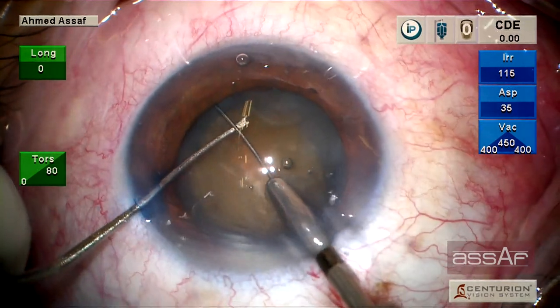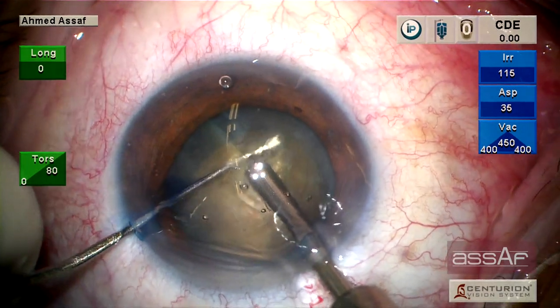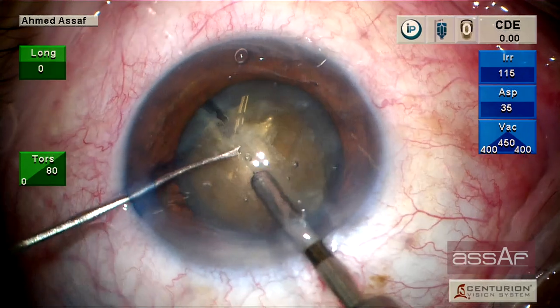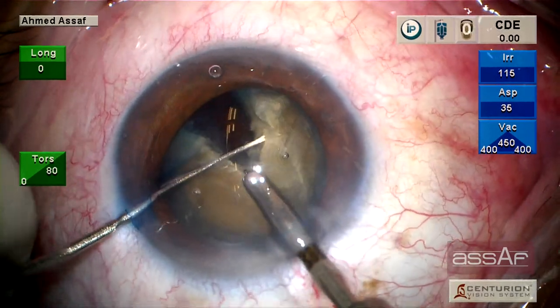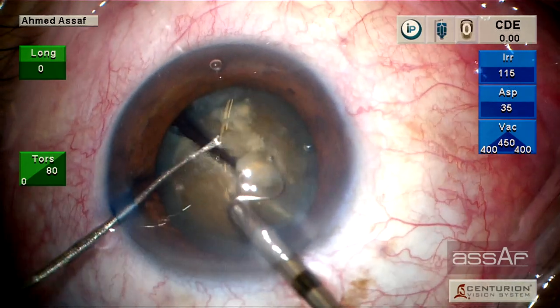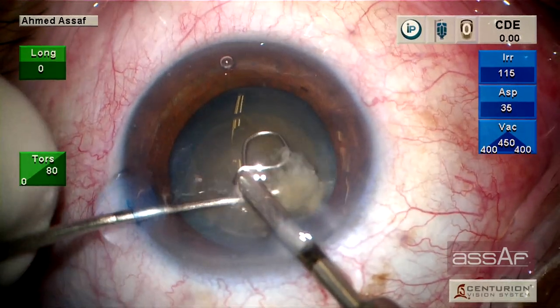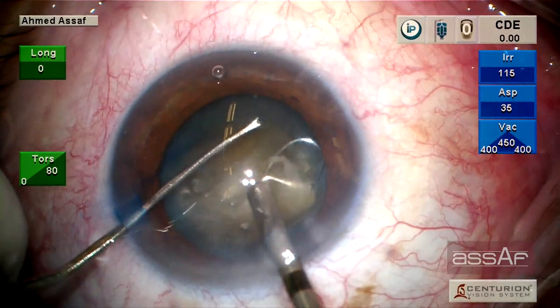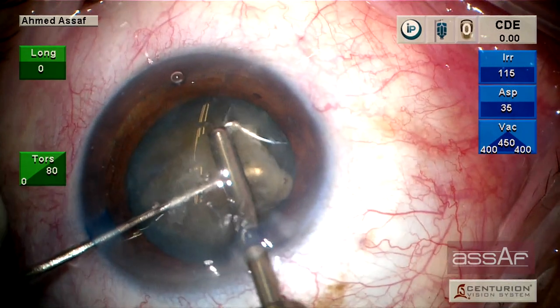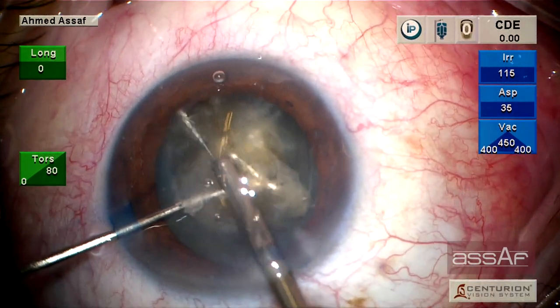We have to keep this reflex just below the MyLoop. Now by retraction of the lever, the MyLoop will cut through the nucleus into two halves. We can support the lens nucleus to prevent evasion, which sometimes occurs in some cases. Now the lens nucleus has been divided completely into two halves. We can give the MyLoop another try to divide each half into two quadrants.